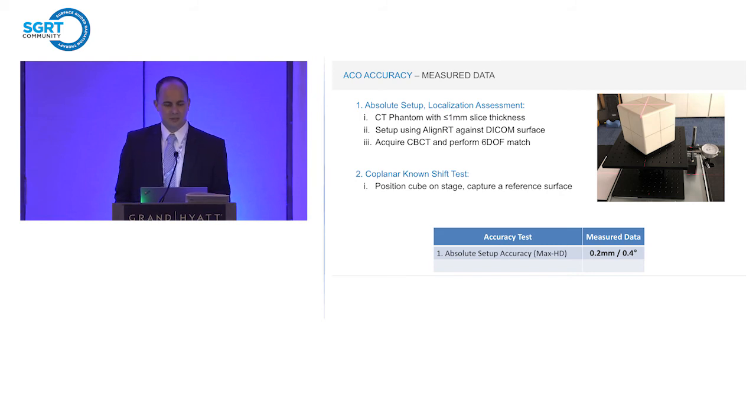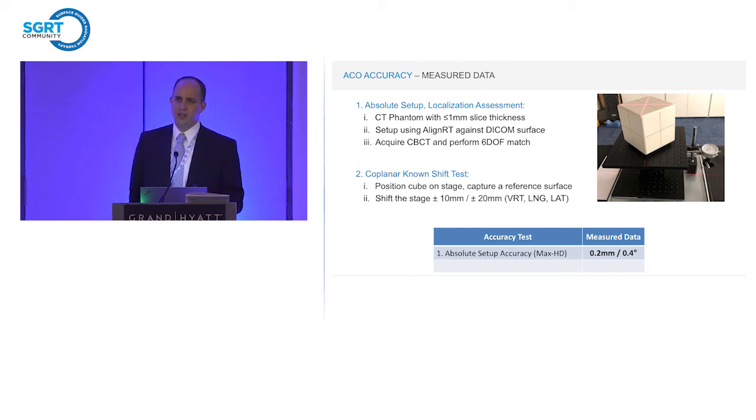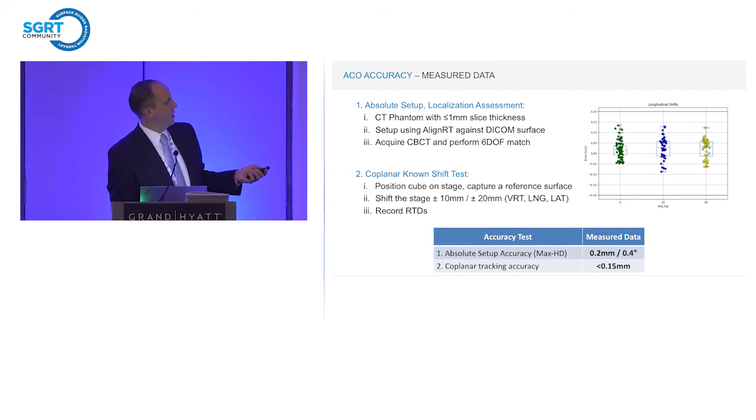displacement of the phantom. So the idea is we position our cube again at a 45-degree angle, and then we shift the cube plus or minus 1 and 2 centimeters in the different translational directions. And then using Align RT, we measure the actual real-time deltas against the known position of the cube. I'm showing here in this figure, it's a little hard to see, just one of them. This is just for longitudinal shifts.